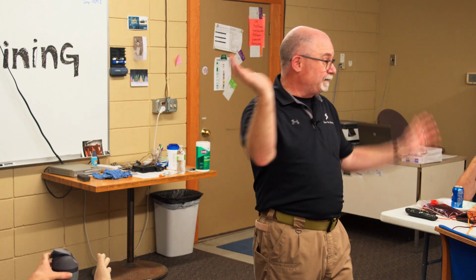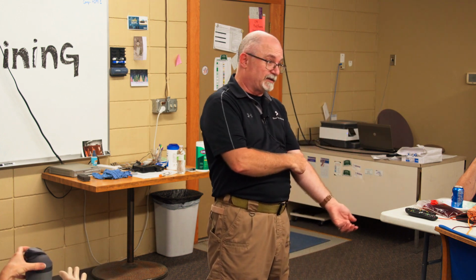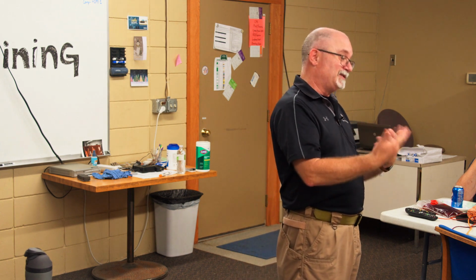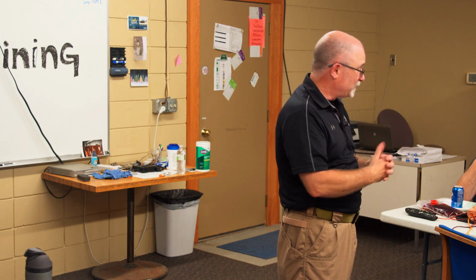Give them 200-300. If I know somebody's really dehydrated, like heat exhaustion, I'll give them 500 real quick and then slow that back down. But not just, whoop, now I'm done. We still have to reassess. Keep checking the site, listen to lung sounds, record your vitals, especially if they're sick enough that you're doing fluid. How often do you want to do that? About every 5 for critical patients. Sometimes it turns into 7 when you're so busy, but for stable patients, 15's fine. If you want to split the middle and go 10 on every patient, you'll be a little late and a little early, so who cares?